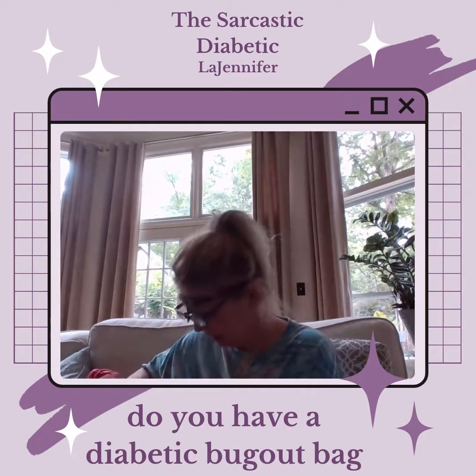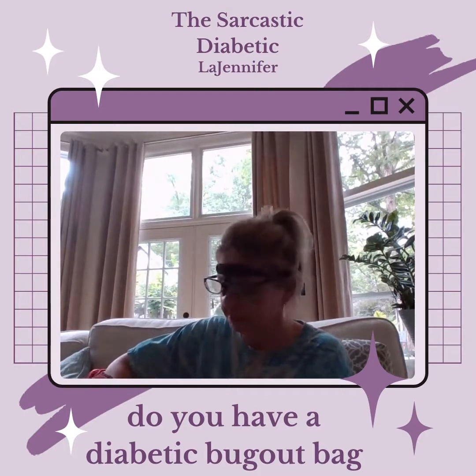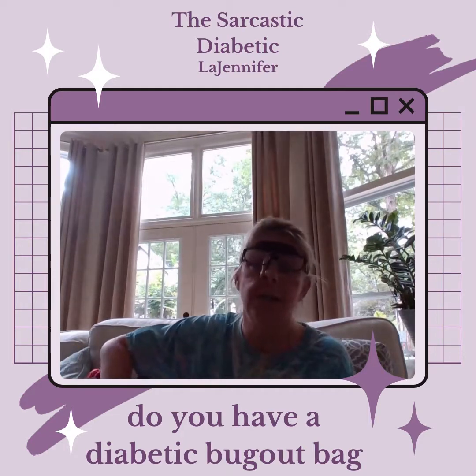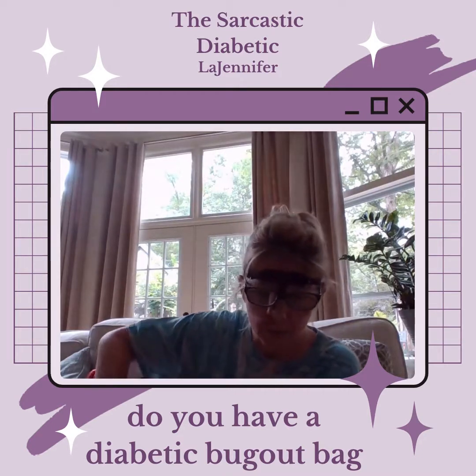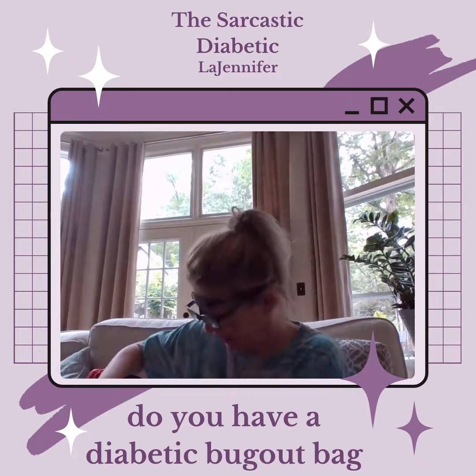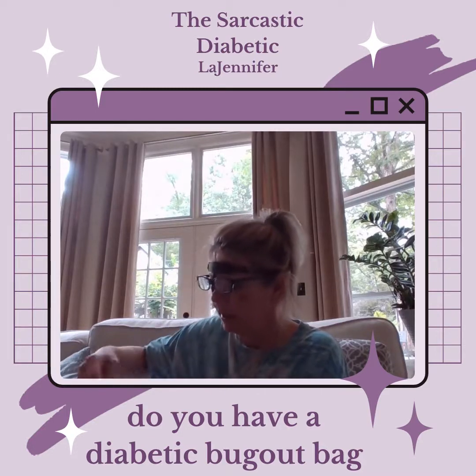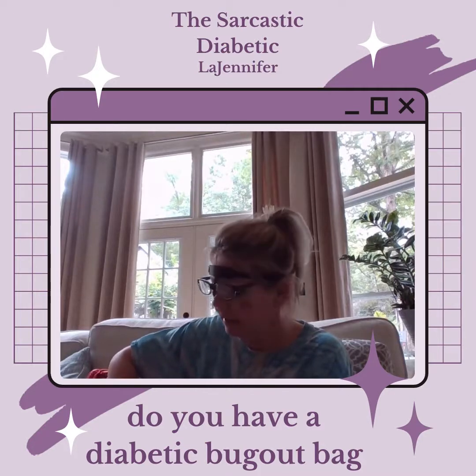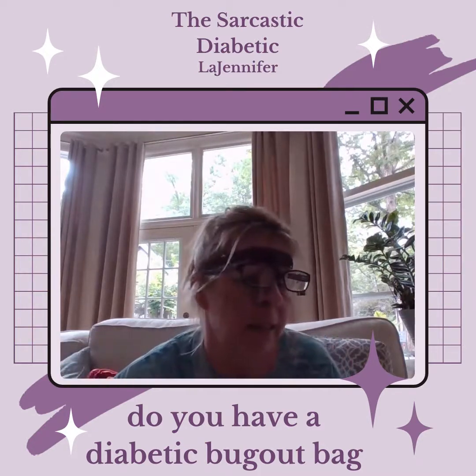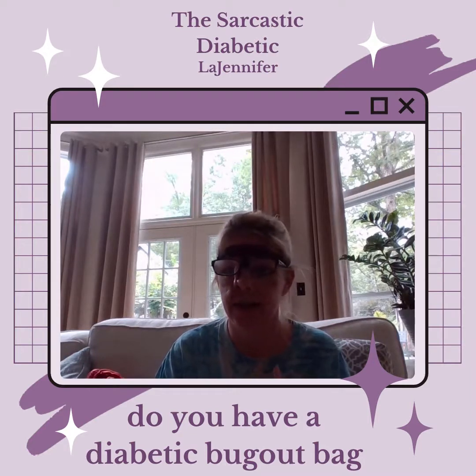Then I always put, of course, my insulin pumps, my G6, an extra G6. Oh, and I always carry at least 3 insulin pumps. I've had 2 go out on me before, mess up on me. It happens, I mean, my luck. But it does happen. Always carry extra tape if I decide to use it. Wipes, extra wipes. I make sure I have my PDMs for both my Dexcom and my Omnipod.